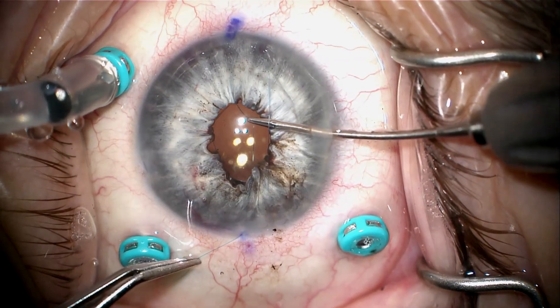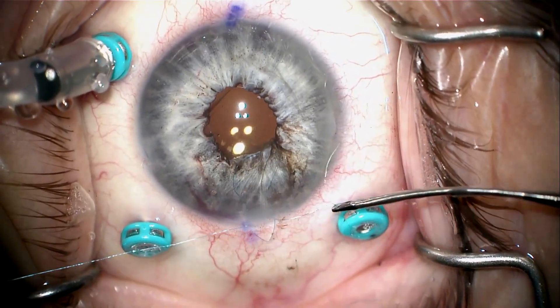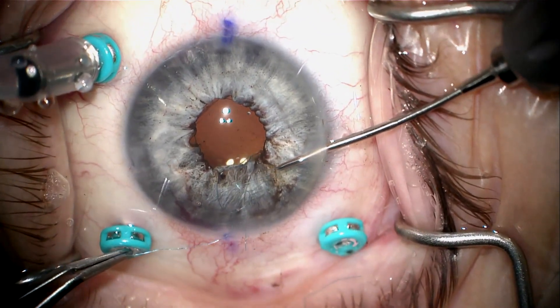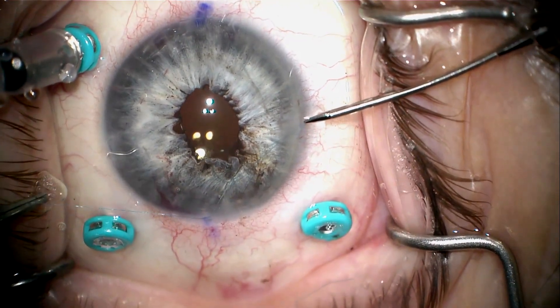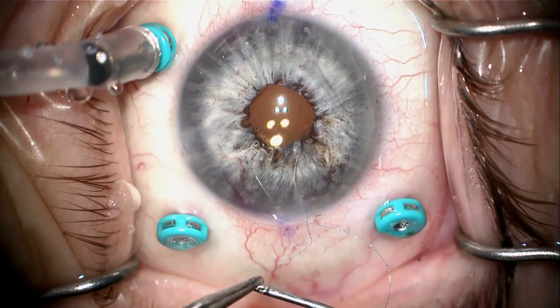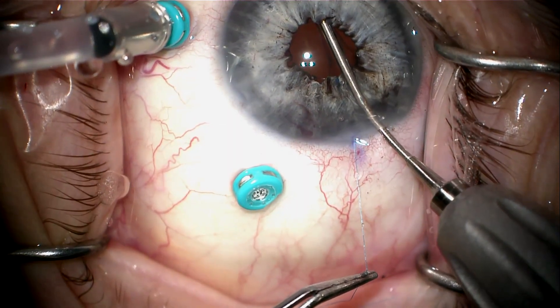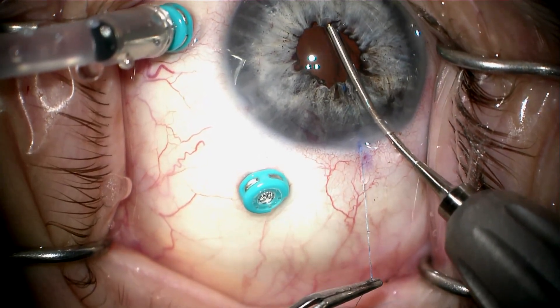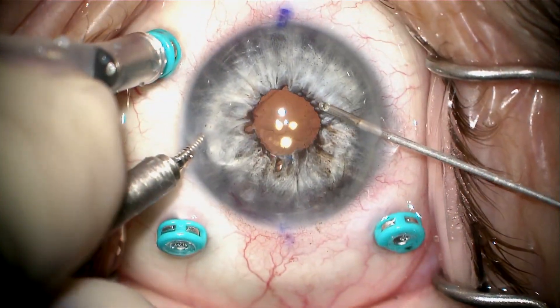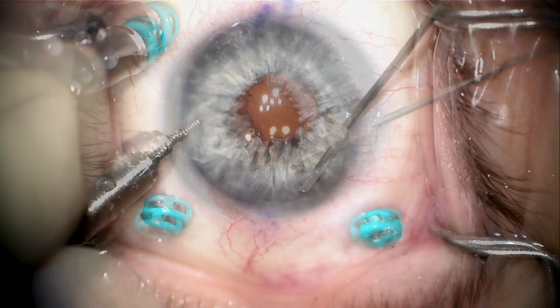I'm trying to bring the pupil down to match the other eye, around 3 to 3.5 millimeters. I have to be careful not to make it too small, because when I lock the three-throw with a single pass — the first locking throw — tightening it brings the pupil opening down about another half to one millimeter. Now doing the final reverse throw: it's 3-1-1. This locks everything at the final pupil size. I cut on both sides, completing the cerclage, which looks nice, round, and smooth. We remove the viscoelastic from the anterior chamber with the anterior infusion.